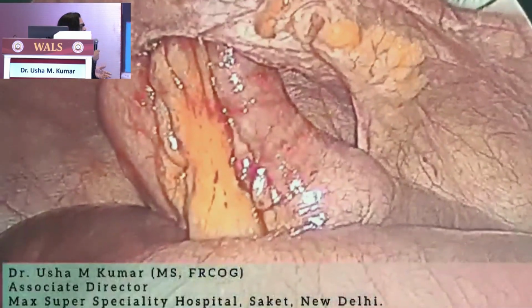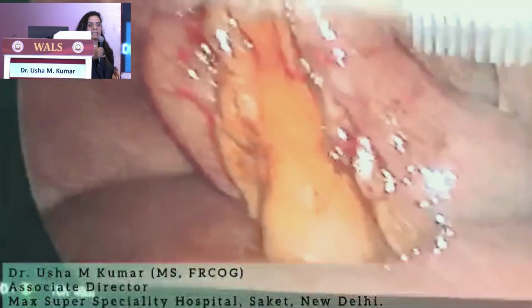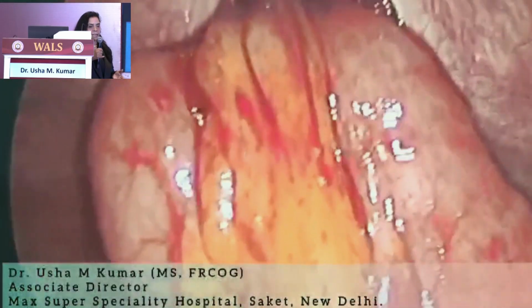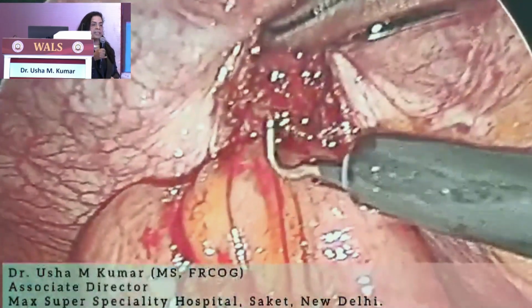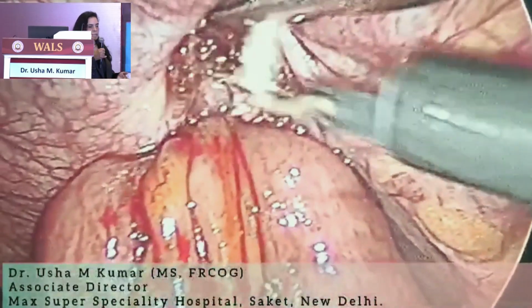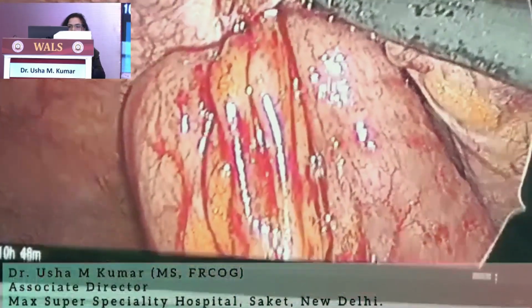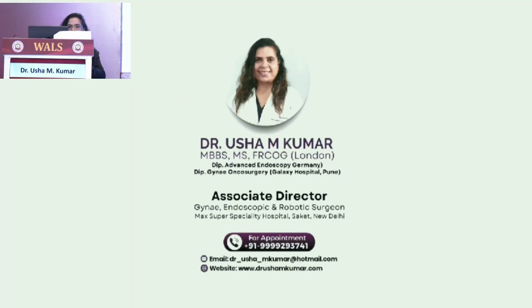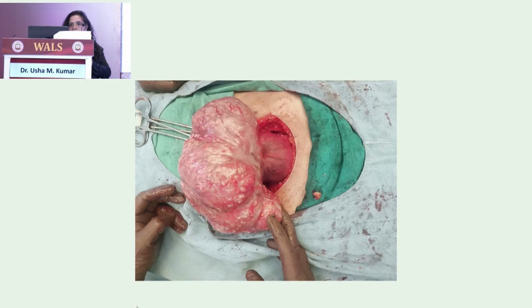If this is diagnosed within 48 hours of strangulation, luckily the bowel can regain its color and no necrosis or gangrene happens. But if it is more than 48 hours, then there is a possibility of gangrene of the bowel because of the hampered blood supply, and the patient might end up with resection anastomosis. So please do pay attention to the 6 millimeter port as well. So I told you about the uncontained morcellation.